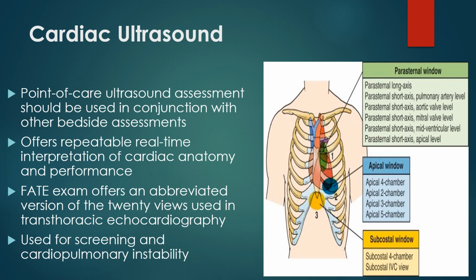And with some of the new handhelds, and don't get me wrong, the handhelds are not as good as the consoles, but they're getting there. But with the evolution of the handhelds where you can just pull something out and read it right off your phone, I mean, what more could you ask for? But at the same time, perioperative ultrasound often involves a console and often involves collaboration with the surgeon, especially if you can't really get to the chest with a transthoracic echo probe.